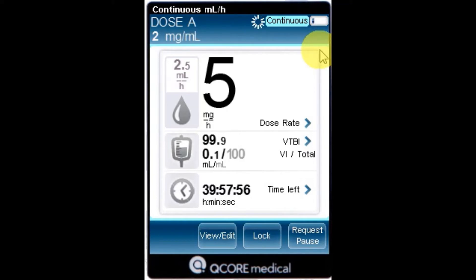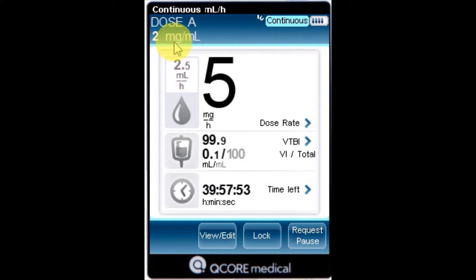Drug concentration: the drug concentration as entered by the user. The final concentration, or drug amount over the diluent volume, is displayed when applicable.